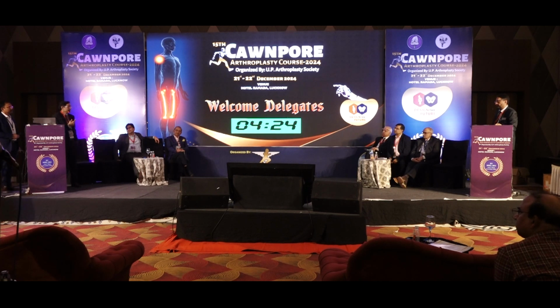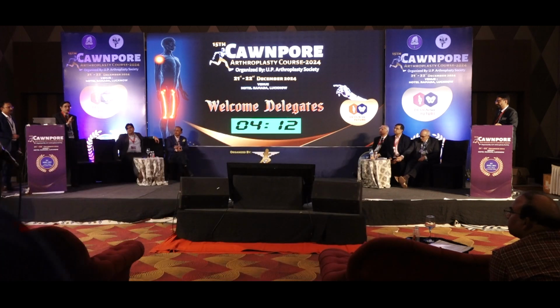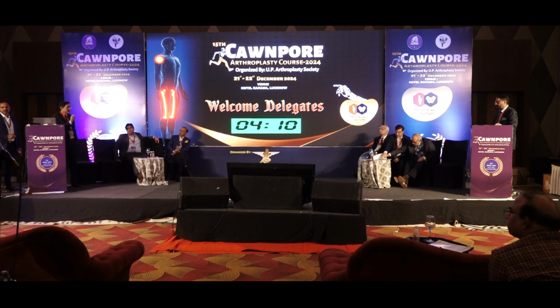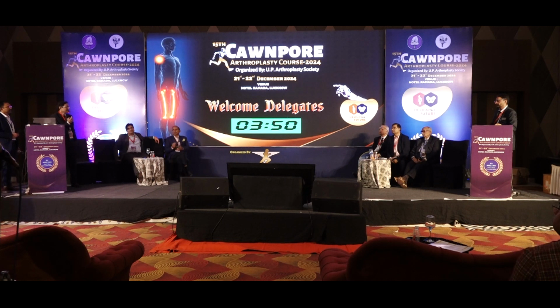PS is hardly 5%, especially with the advent of the deep dish poly, or different people have different names for that. And I think in the Indian scenario, the box and osteoporotic bone and the two holes there are the biggest worry. Otherwise, I think there's no difference between CR and PS. They both work very well. PS is more forgiving. You get better range of motion, and it's more forgiving. But if you're not replacing the patella, then CR is much better. That's my take. Can I add?